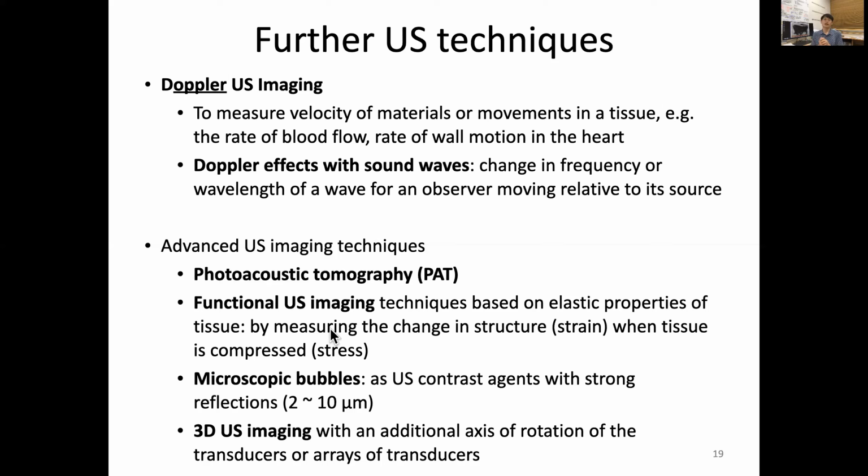Also, like X-ray, ultrasound can have a contrast agent, which is a microscopic or nanoscopic bubble, around 2 to 10 micrometers in diameter.